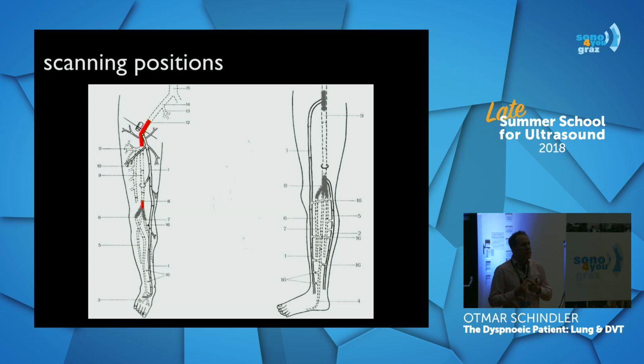And the 2-point scan is quite good at the moment where you have a symptomatic patient. So it's good if you have a patient with a swollen leg. It's not that good if you have a patient with suspicion of pulmonary embolism, and it's not at all good if you have a healthy patient. You don't know if something is happening. Yeah? But as soon as you have a symptomatic patient, just do a 2-point compression ultrasound of the leg veins, and you will know a bit more.